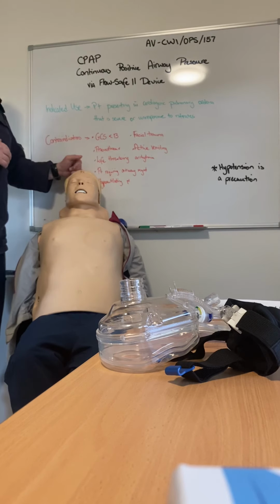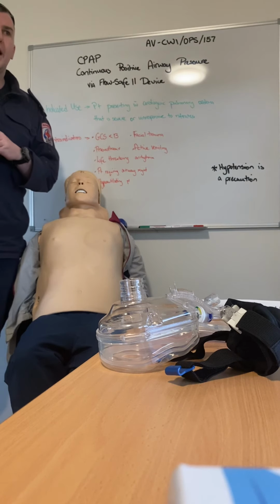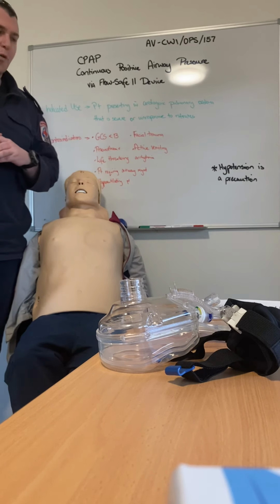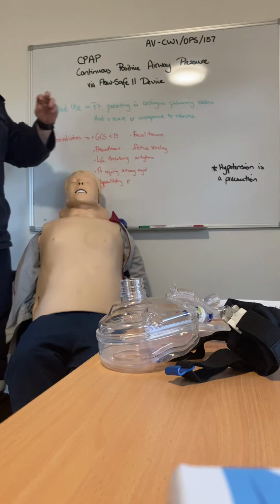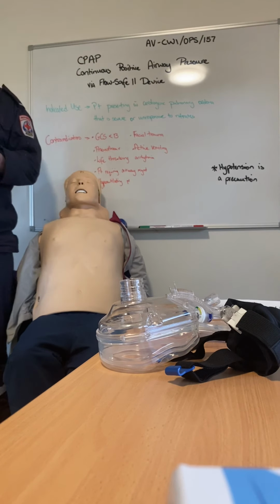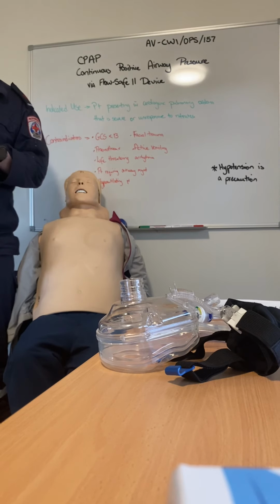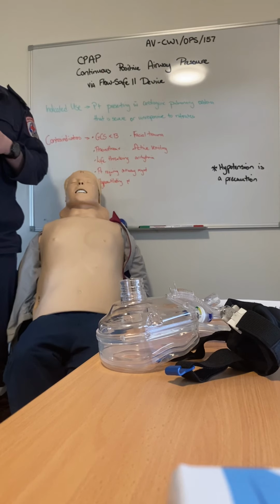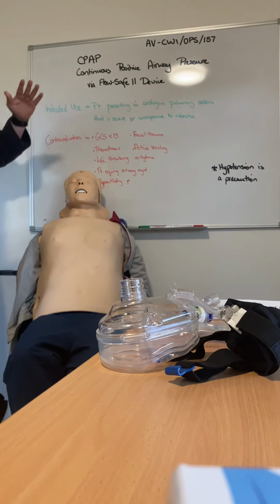Patients that are hypoventilating, so patients who already have a low respiratory rate, they're probably already going to have a decreased GCS score, but for our hypoventilating patient, we are not to utilise the CPAP. I've made a note over the side here: hypotension is a precaution only with positive pressure ventilation. I'm sure you're all aware of it now, but positive pressure ventilation can cause a decrease in venous return, so adding that extra CPAP involvement would knock off their venous return as well, causing a crook patient.